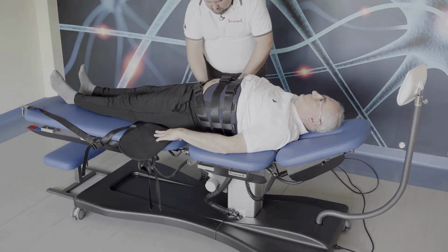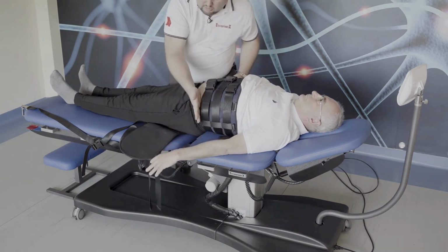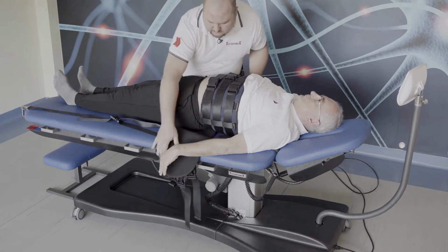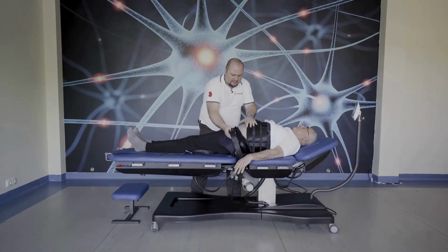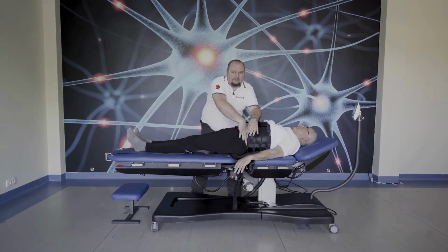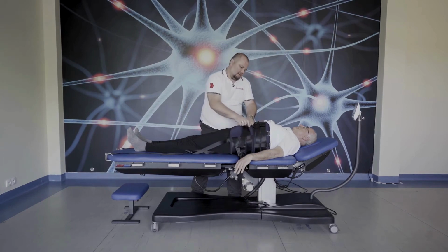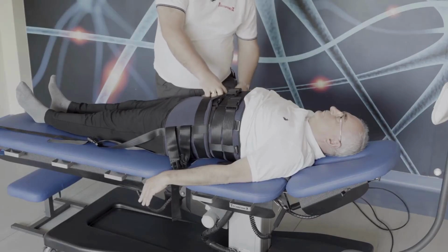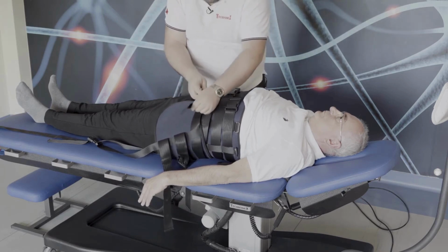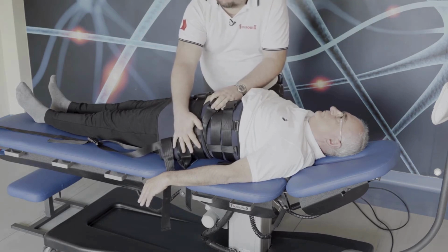The other belt, the lumbar one, should be higher than the pelvic rim. So the highest strip of the lumbar belt should be above the pelvic rim. So we close it. At this moment, very easy. As you see, the lumbar belt is on the thoracic one.